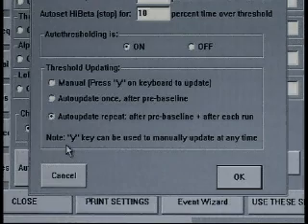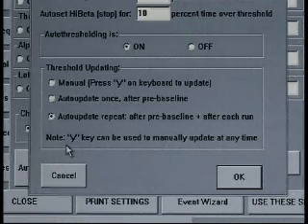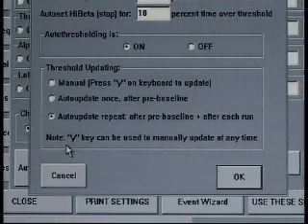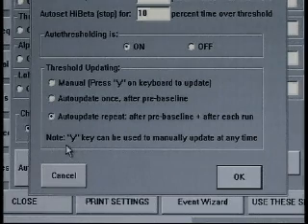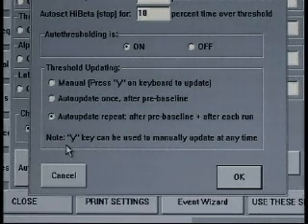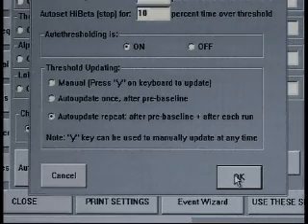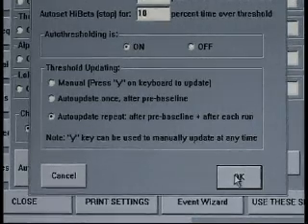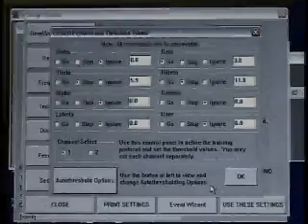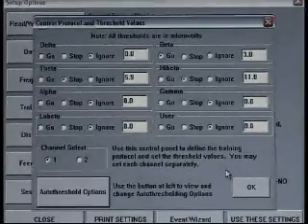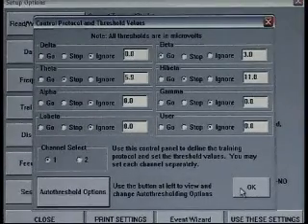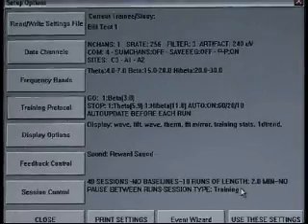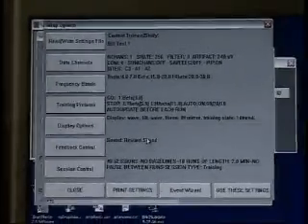Note also that the Y key can always be used to manually update at any time. So if we see the thresholds are a little too easy or a little too hard at any point of the session, we don't need to wait to the next run. We can simply hit the Y key and update them at that moment. Since we've made some changes, we want to remember to always use the OK button to close the window. As we close the window, we go back to the control protocol and threshold value screen. Again, we click OK once more, and we're back to the setup option screen.